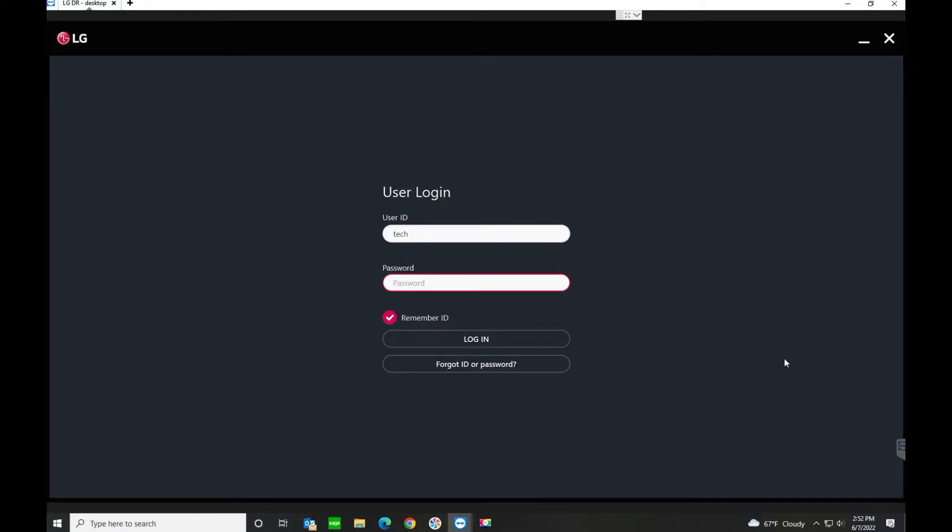In this video we're going to be going through the new LG version 3.0 advanced workstation software for the LG DR systems.